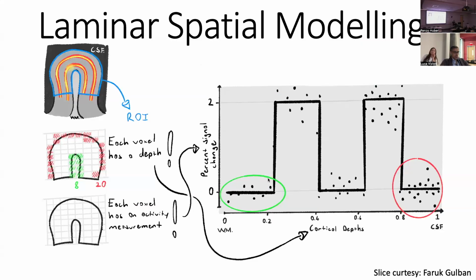We don't need to even them out, which I see sometimes in layer-fMRI papers out there, that they try to match the number of voxels per different layers. And because then it's easier with the statistical certainty. If you do more free statistical analysis, this would be easier.